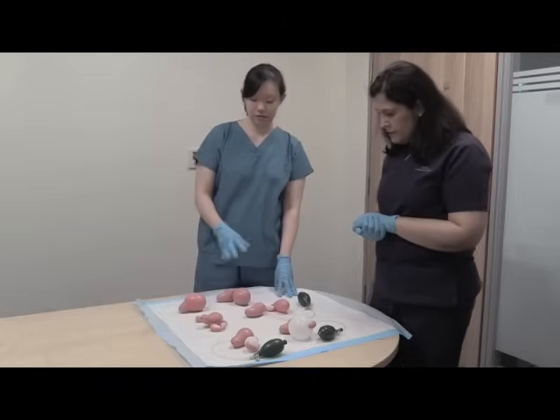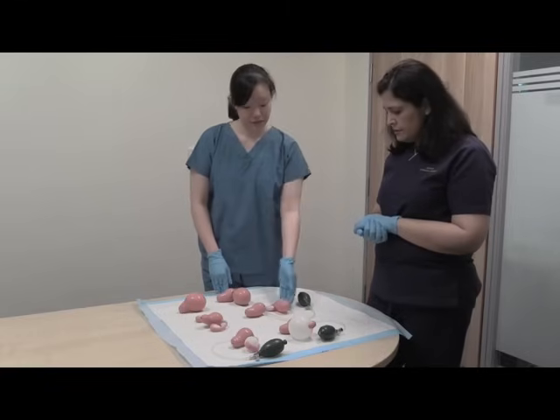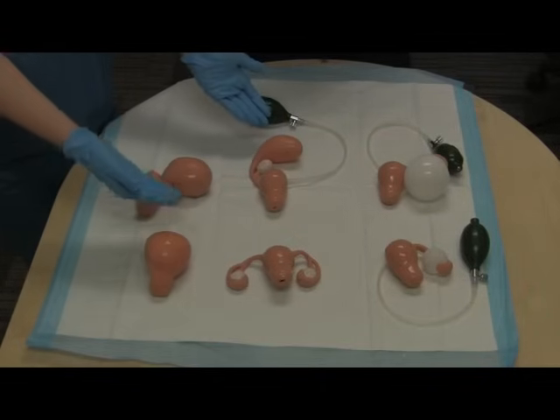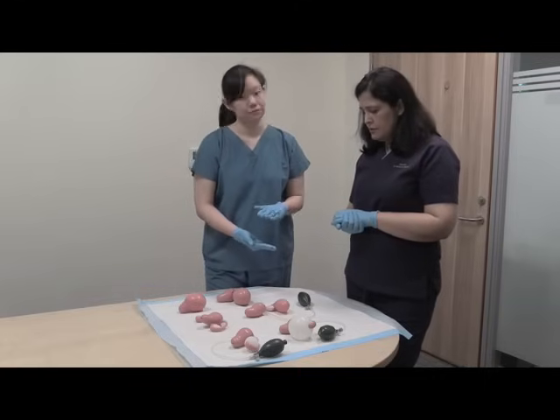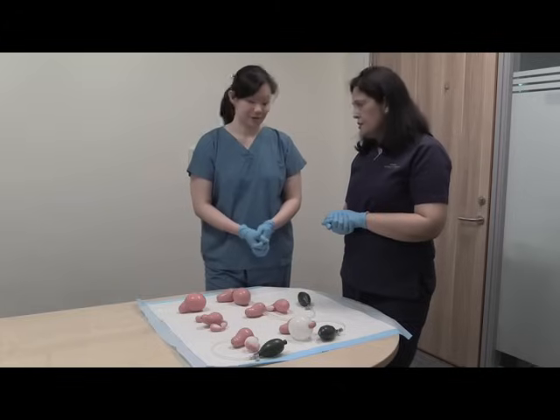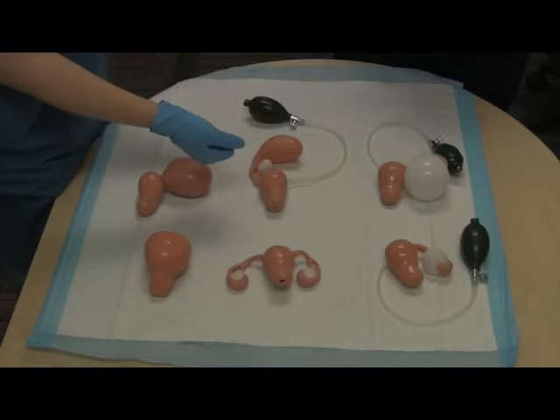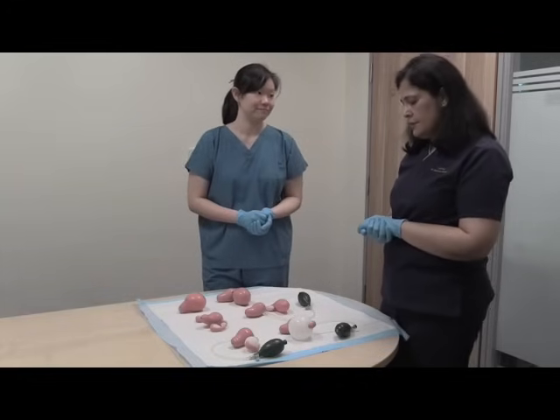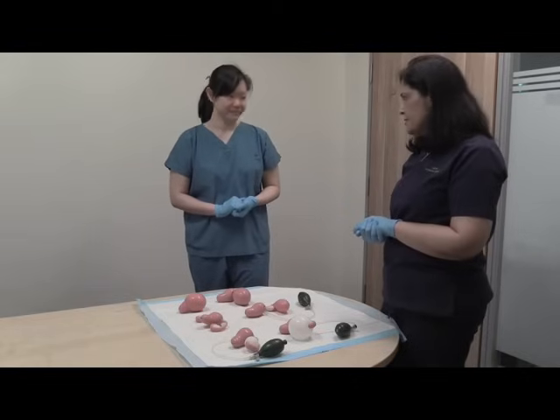Besides uterine pathologies, we also need to practice and be familiar with adnexal problems and ovarian problems. In this case, comparing to the normal model, the tube here is enlarged — this is most likely a hydrosalpinx. When we fit this into the trainer, we can actually palpate the adnexal structures and feel for the presence of a hydrosalpinx. We can also see two varying sizes of ovarian cysts or masses. This model is inflatable so we can actually alter the size of the cysts — obviously the larger the cyst, the easier it is to feel on the pelvic trainer.